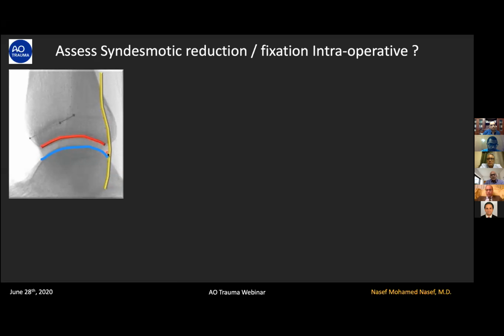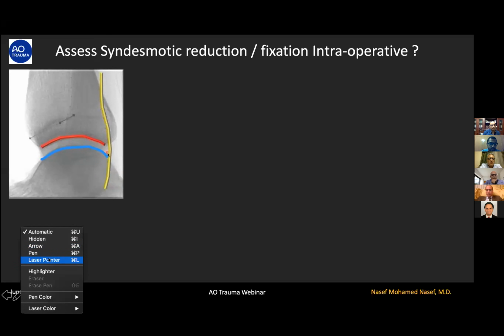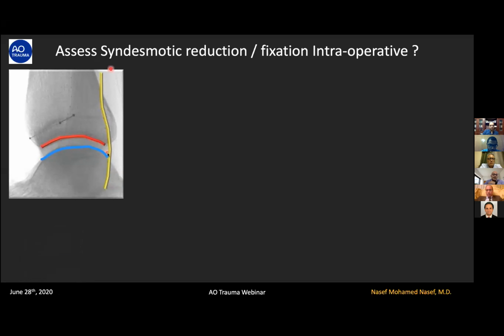If you take a line across, this is a radiological also with the fluoroscopy. If you take a line along the posterior, this is the most important part, it has to be a dead lateral, so the 2 domes of the talus are superimposed as one line. This talar dome has to be exactly congruent with this.